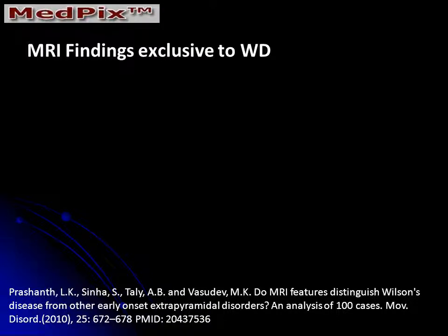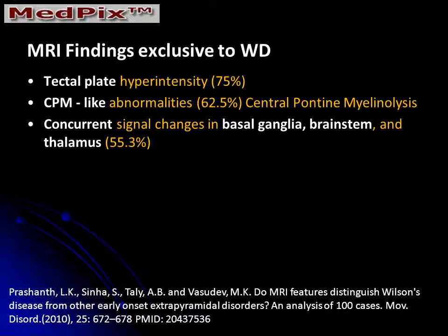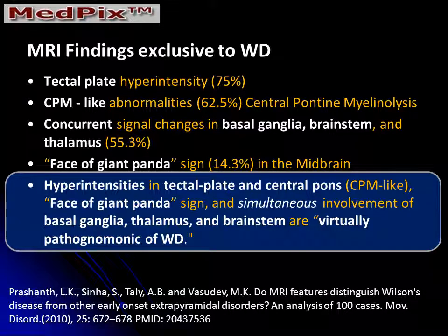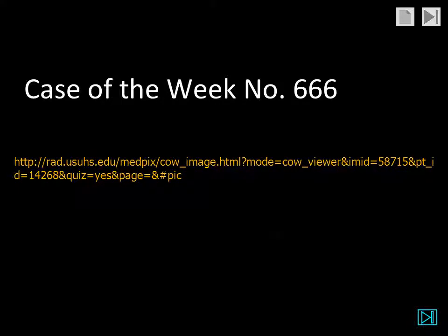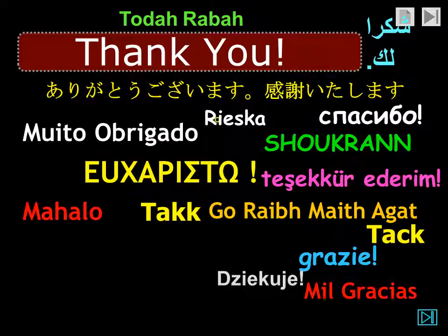The MR findings exclusive to Wilson's disease include tectal plate hyperintensity, CPM-like abnormalities in the central pons, and concurrent signal changes in the basal ganglia, brain stem, and thalamus. The face of the giant panda sign is only seen in about one out of seven patients with Wilson's disease. The hyperintensities in the tectal plate and pons and the simultaneous involvement of the basal ganglia, thalamus, and brain stem have been described as virtually pathognomonic of Wilson's disease. These features were seen in this index case. This has been MedPix case of the week number 666. You can earn CME credit by visiting our website.